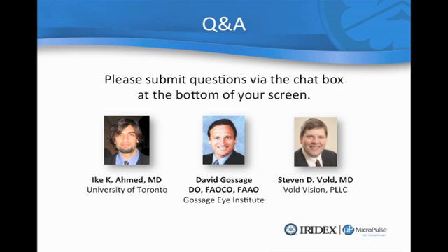Well, I'll just say for those who have an SLT, one of the things that I found, at least in the past, is that the SLT was a little bit of a sensitive laser, and so we would at times have that thing break down from time to time. It's also a little bit more limited in its functionality. So for people that have SLT and it's working well, I'm not sure you have to reinvent the wheel, but if you're purchasing another laser and you want one that has multiple functions, the Iridex laser, the 532, is hard to beat because, as David illustrated so nicely in his talk, it has so many different functions.